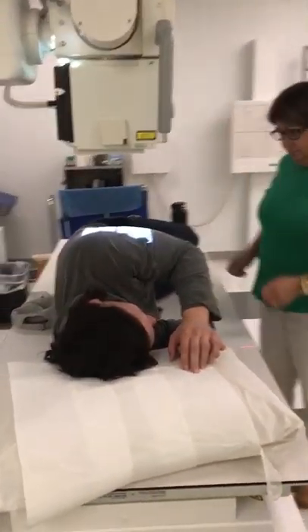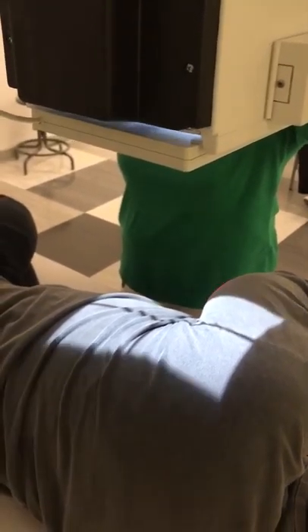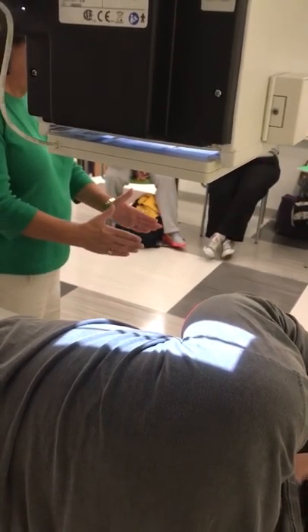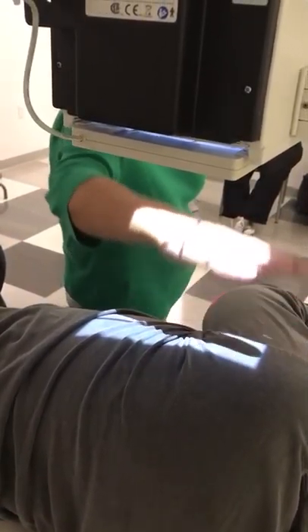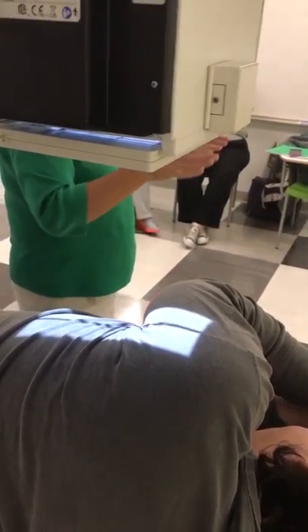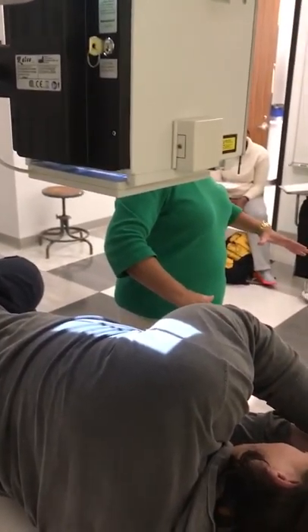And now we're centering the mid coronal plane. And we will collimate to 6 inches. Now, people have noticed that is not 6 inches. That light is much less than 6 inches. Well, by the time that light diverges and hits the IR, it's 6 inches wide. But because his body is so close to the source, it makes the light appear smaller. But that light field spreads out as it travels.